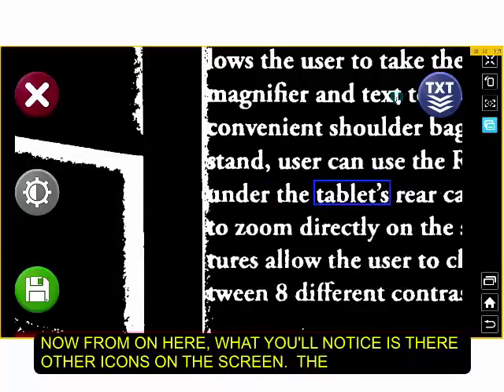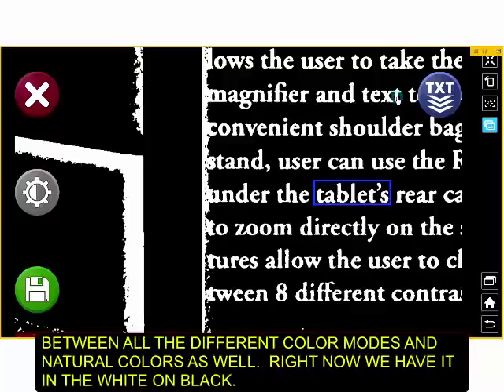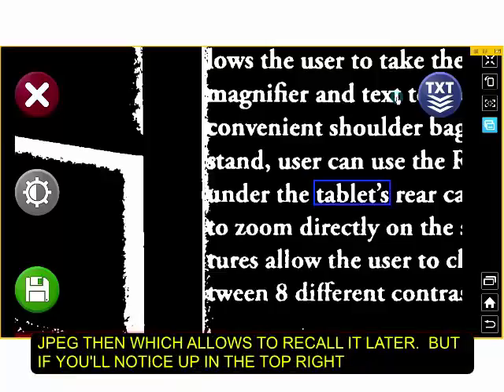Now from here, what you'll notice is there's other icons on the screen. The top left red X is obviously to exit out. The next one down actually will change the color modes, and you can cycle between all the different color modes and natural color as well. Right now we have it in the white on black. Below that is that same save button from before. Now that will also save it as a JPEG, which then allows you to recall it later.